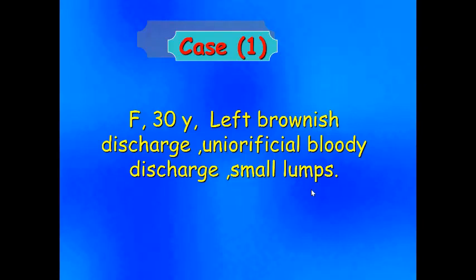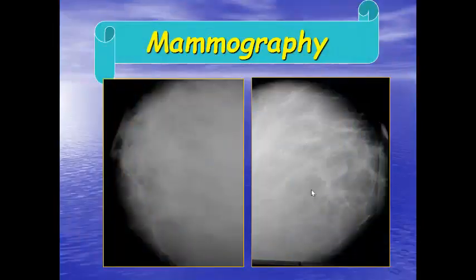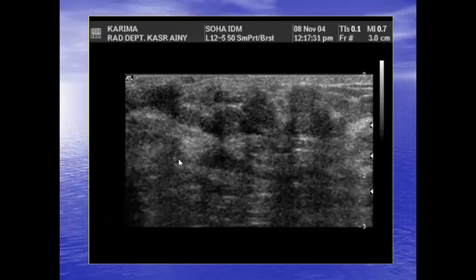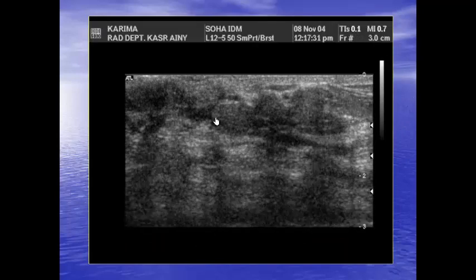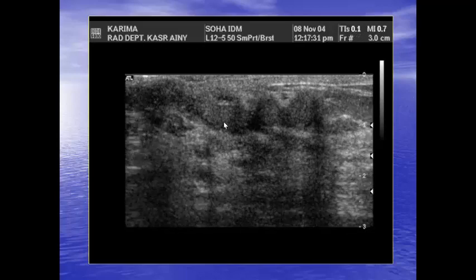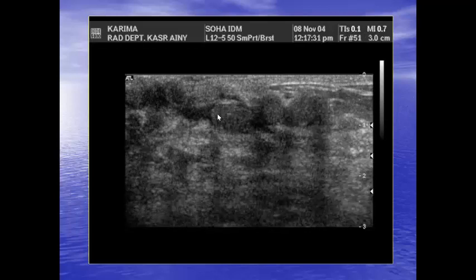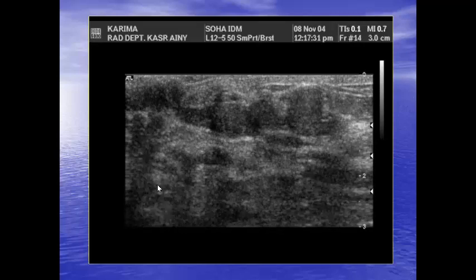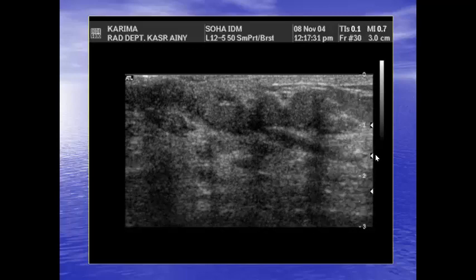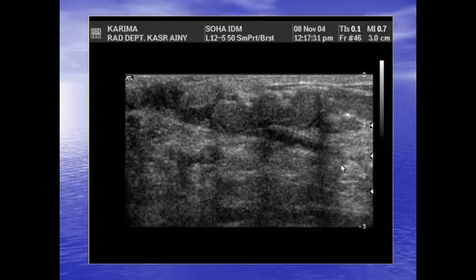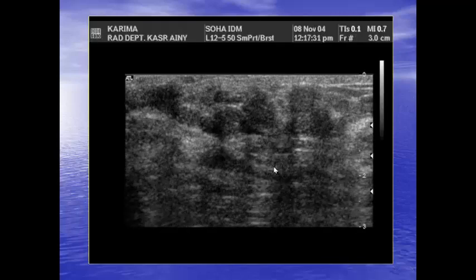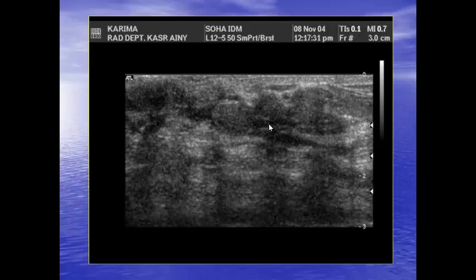This is a case of a 30-year-old with left brownish discharge and uni-orificial bleeding. The mammogram is non-specific with no definite lesion seen — BIRADS 0. On ultrasound, we have intraductal masses: the duct is splayed on the mass, and there is another one and another one. This is the appearance of multiple intraductal papillomas — first, second, and third papilloma. In our report, we write 'intraductal masses, likely benign-appearing, BIRADS 4' because any intraductal mass must be biopsied.